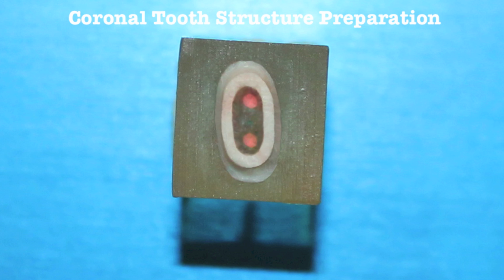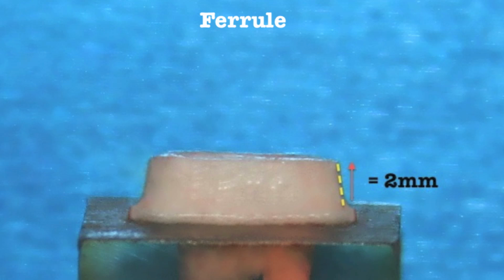Be sure that part of the remaining coronal tissue is prepared perpendicular to the post. This will create a positive stop to minimize wedging and subsequent splitting of the tooth. Make sure to have at least 2 mm of the coronal tooth structure above the finish line to gain a restoration with a ferrule.